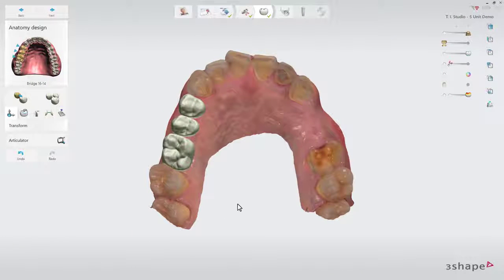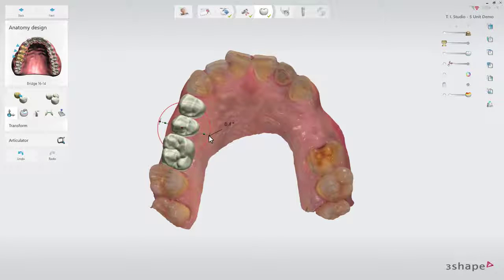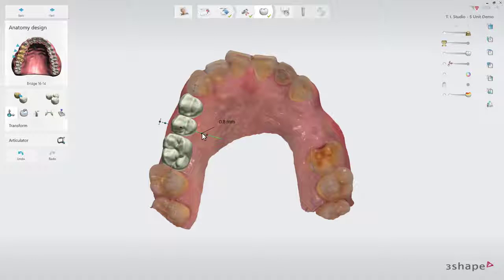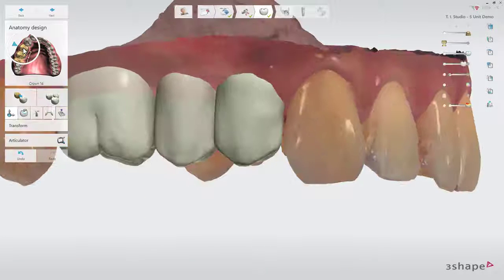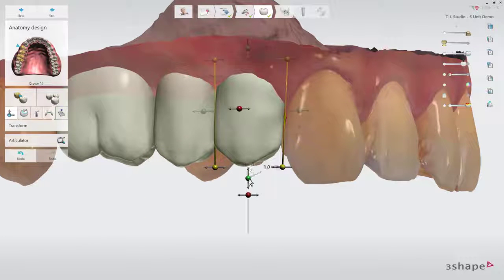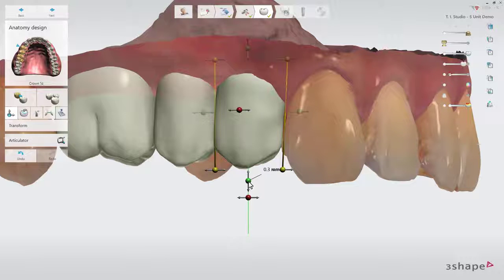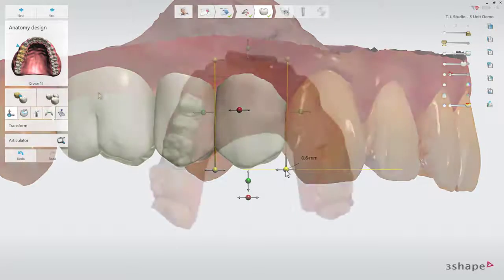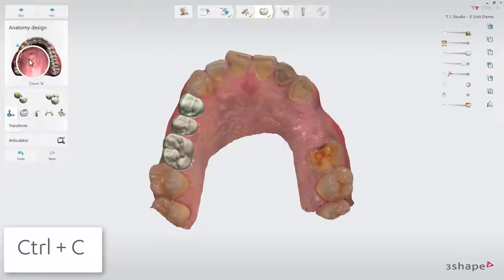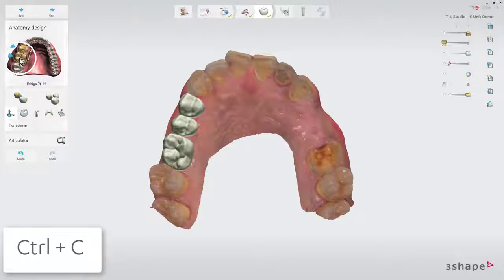At the anatomy design step, place a three-unit anatomy bridge and adjust the design aesthetically based on your professional experience. If you need to adjust each crown individually, go to the tooth selector in the upper left corner and click on the individual teeth to adjust them. Use Control+C and highlight each unit to go back to the general transformation.